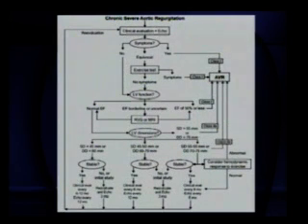And it's important because some of the patients of aortic regurgitation may not develop symptoms, but they may develop LV dysfunction straight away. So in those cases, if you see that the dimensions are increasing very rapidly over a year, or if they have exceeded the end diastolic diameter of 75 or end systolic diameter of 55, or if the EF is low, less than 50%, then such patients should be recommended AV replacement.